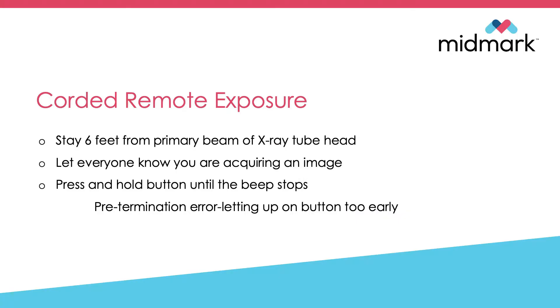Now we'll talk about the corded remote exposure button. On your mobile units, this will be right on the side of your operator panel. We want to make sure we get six feet from the primary beam of the x-ray tube head.